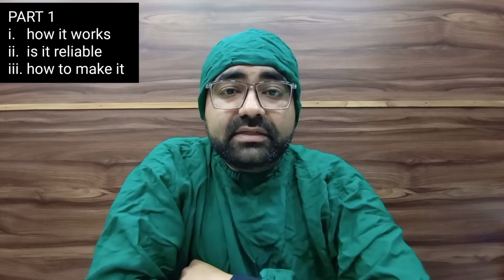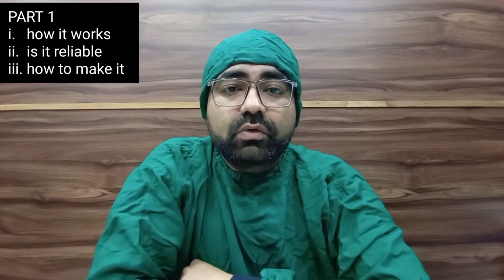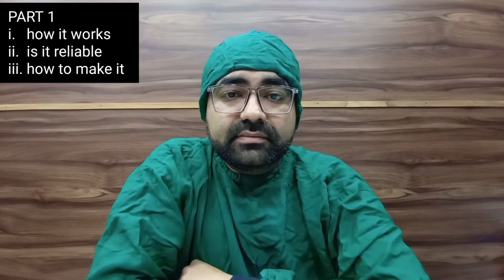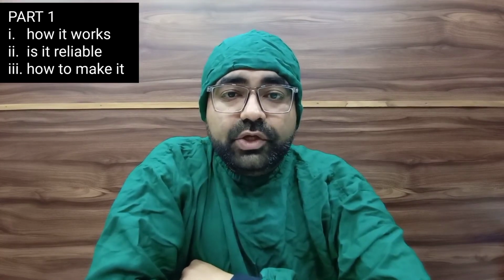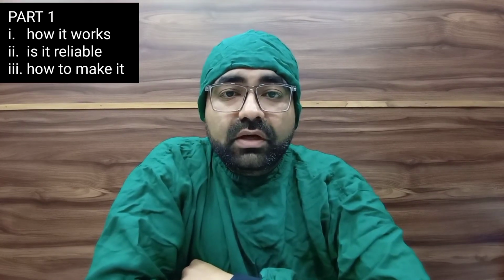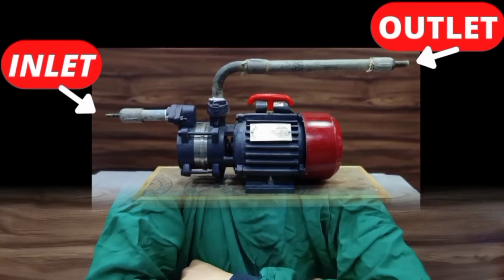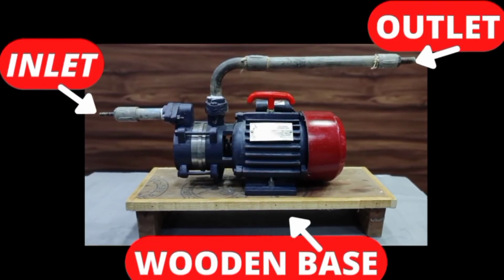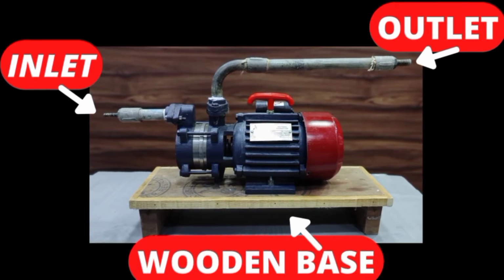If you have any such old water pumps with you, you can also convert them into dental motorized suction. Now let's make this motorized suction. So first you need to learn few basics of any electric water pump. Any electric water pump has inlet and an outlet. The inlet is generally at the front of the pump and outlet is generally at the top of the pump.